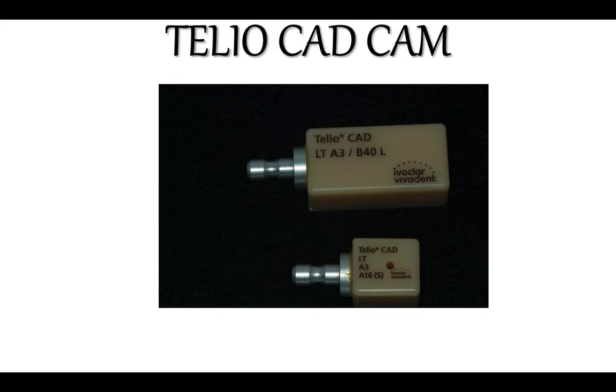You want a perfectly polished provisional that is going to help you heal faster, so that you can cement easily later on without bleeding or the problem of gingival crevicular fluid from inflammation. Then that's a good choice. It's very good to indicate this. The problem is that it's expensive, but I would encourage you to try.